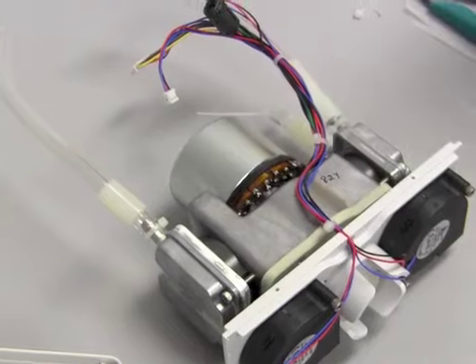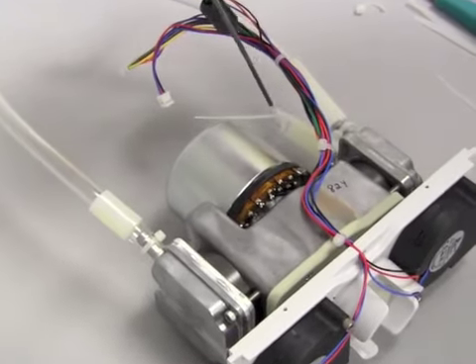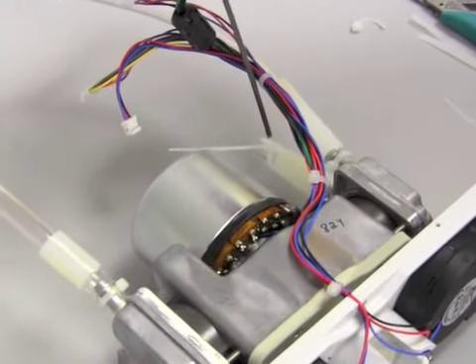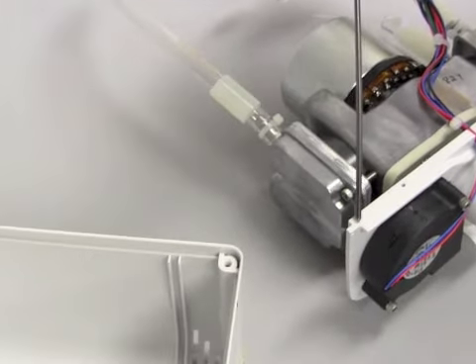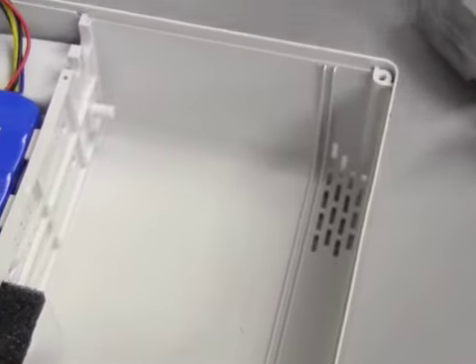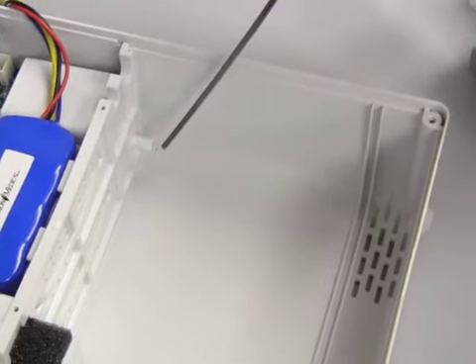Now we're getting ready to reinstall the motor. The first thing you want to do is put a wire tie onto the bottom Tygon, right, so it's in place ready to be tightened, right? The other thing you have to look at is that the fan assembly goes into the slot on the case, right? And that bottom Tygon tube goes onto the nipple inside the case.